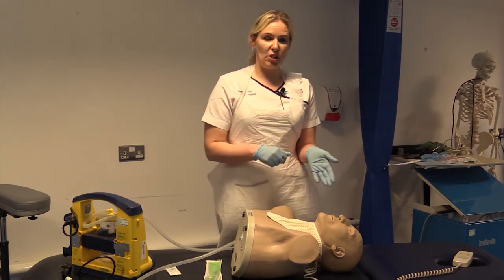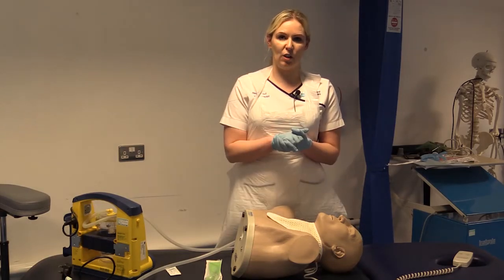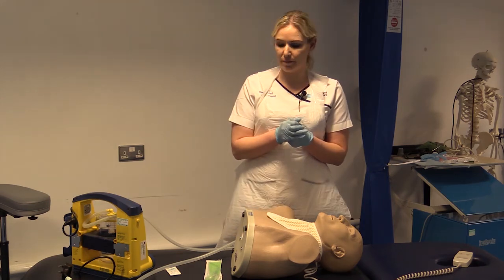Okay, so you're going to explain to your patient what you're going to do. You're going to check your patient's position in the bed, and you're going to check the patient's clinical observations before proceeding with your suction.